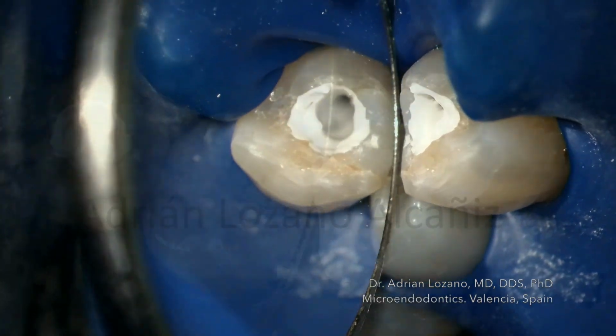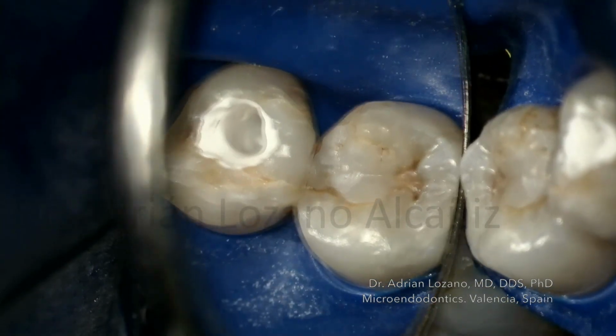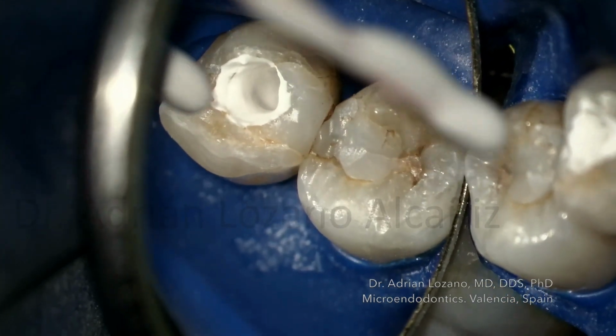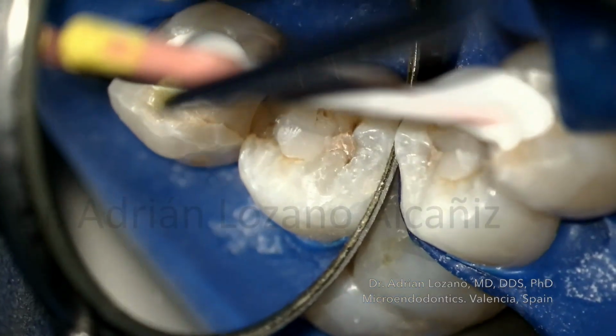Then when we see that all the walls of the canal have sealer, we can cut 1 millimeter of the master cone and go with the master cone to the working length.